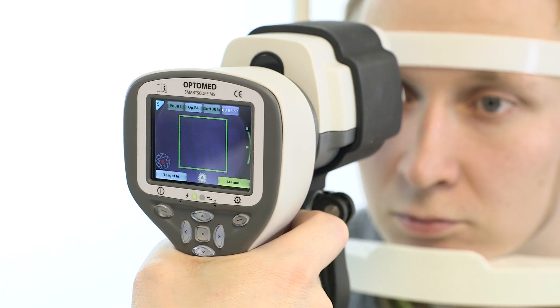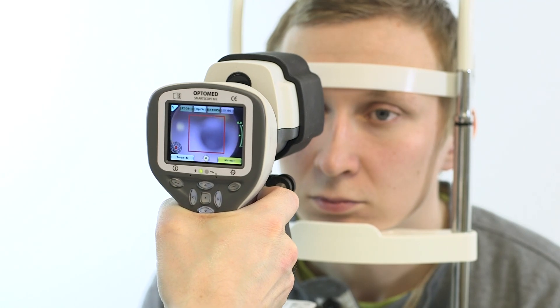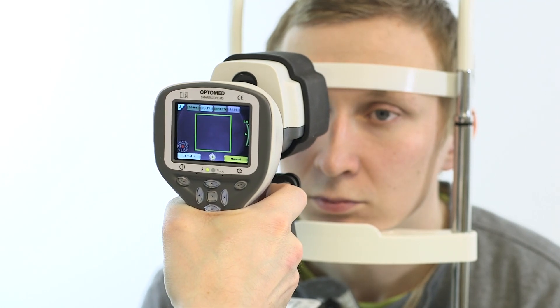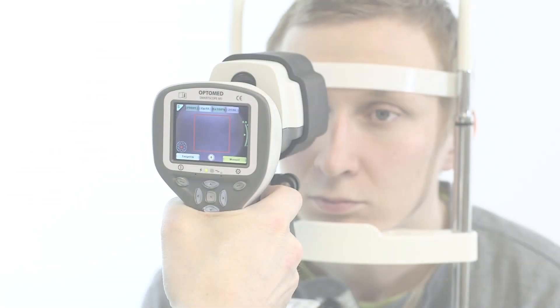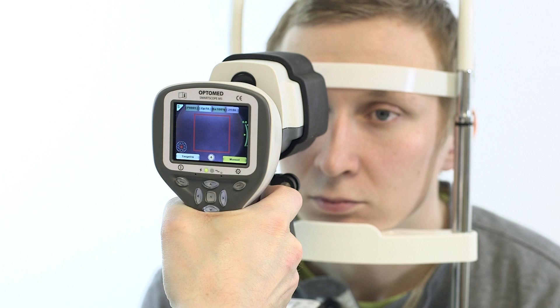Capturing images is quick and easy — 5 images can be taken within 15 seconds. Capture the image by pressing the shutter button when the Aim Help Square is green. The Aim Help feature indicates to the user when the aim on the retina is good for taking an image. If the square is red, then the aim is not good and the retina does not fully cover the image area.